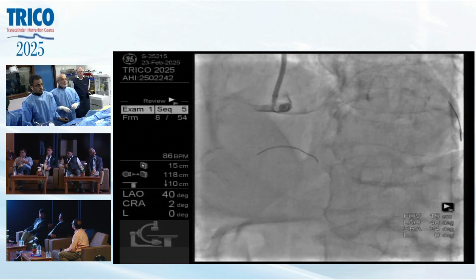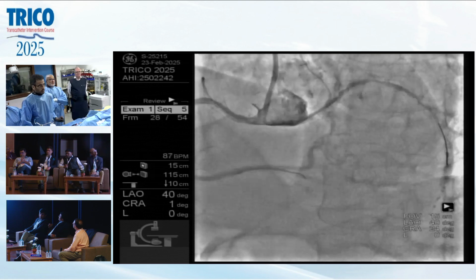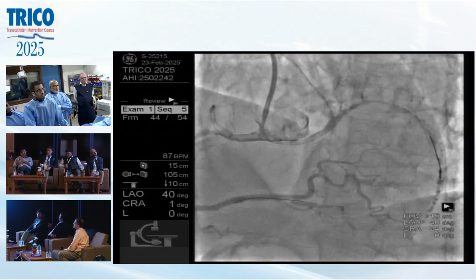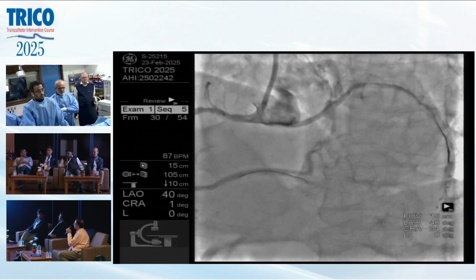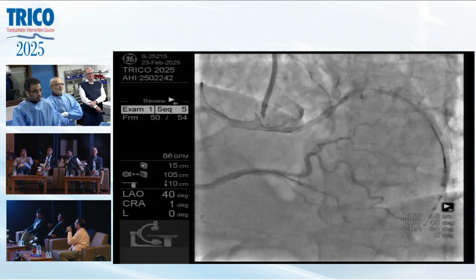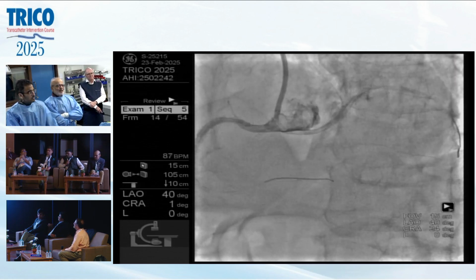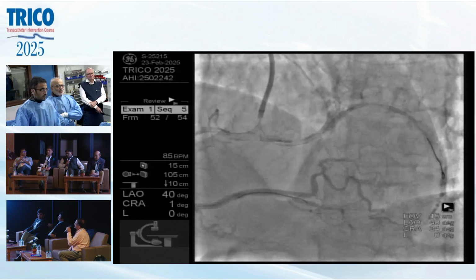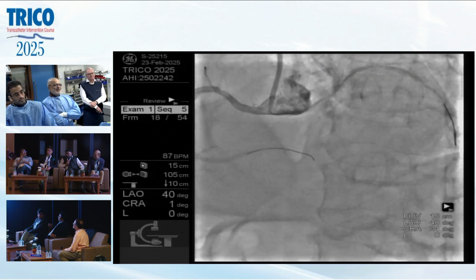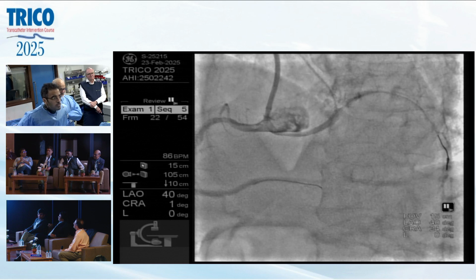Okay. So, how many of you are of the opinion that I should pre-dilate, and how many of you feel that I should simply go in and out? I would pre-dilate because the guide support is tenuous, so better to prepare it. I have a reason to use the balloon here. Why? I will tell you. To suck the guide in. You know it. I know that you know it. But I want to intrigue the young guys about what I am doing.